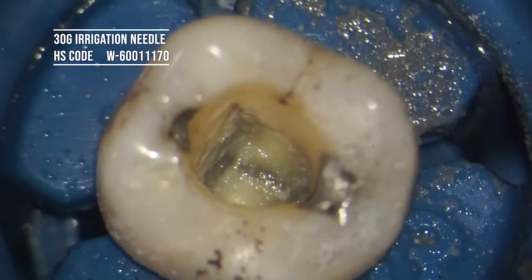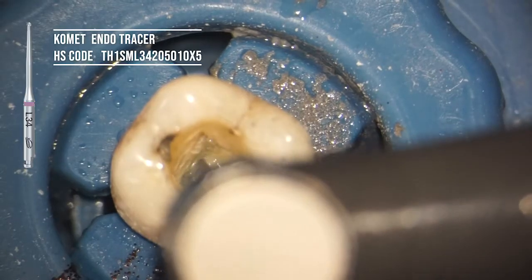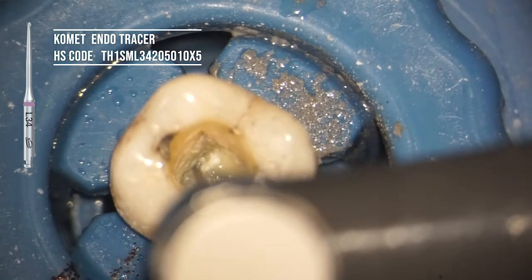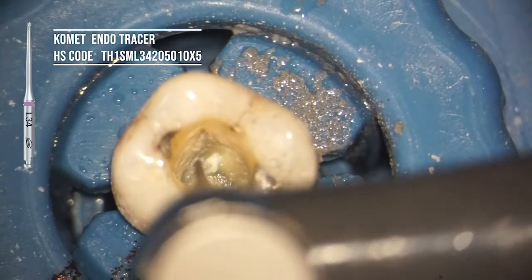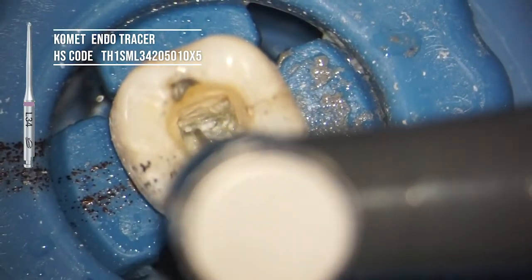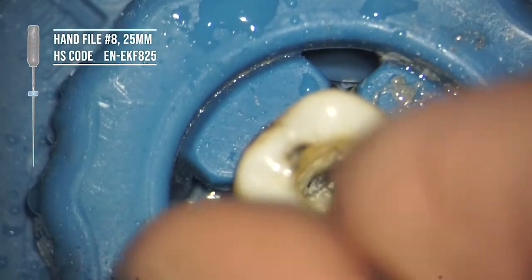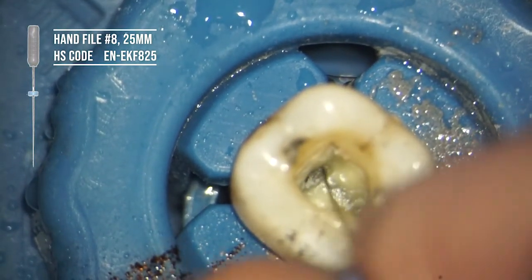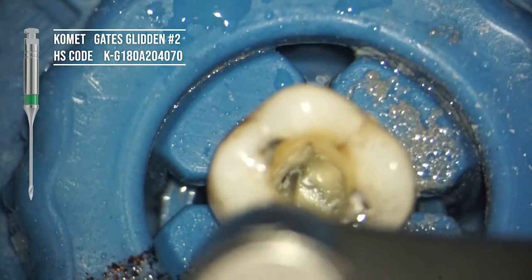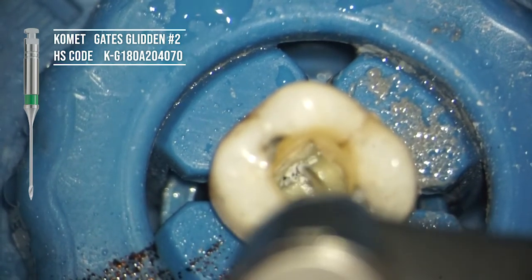And just refining now into the canals using an endo tracer, because I know that that's a very slender opening. Once again, this is told to me from the CBCT. And I'm just opening up here so I can start to get a little bit of straighter line access, exploring the canal system, which is very tight on the buccal, and not so bad on the lingual. I'm just brushing a tiny little bit of pericervical dentine here away, not too much, just getting a little bit of access into that canal.